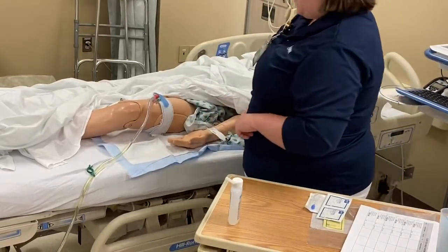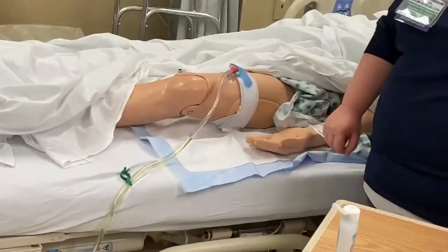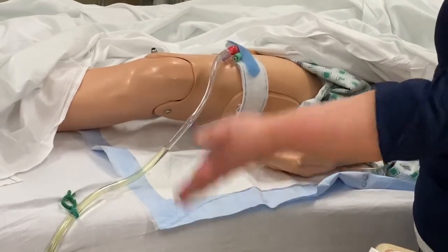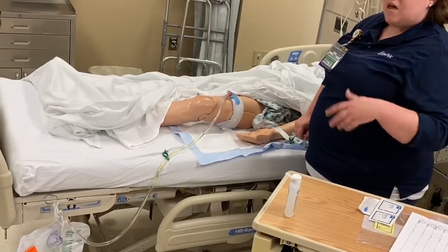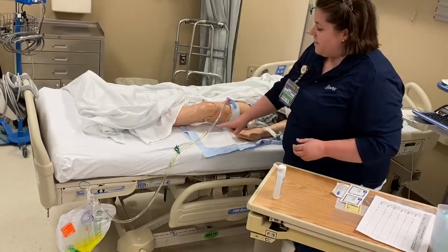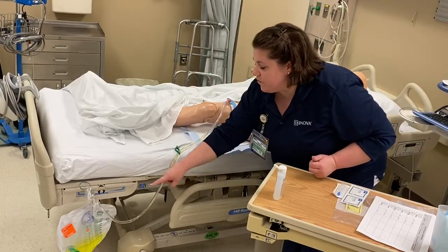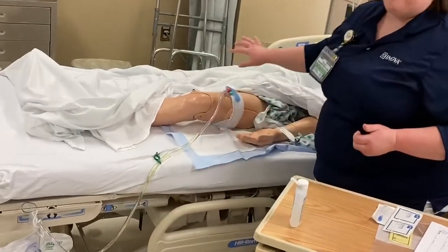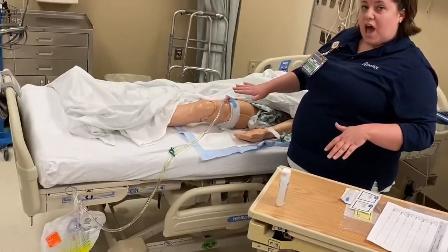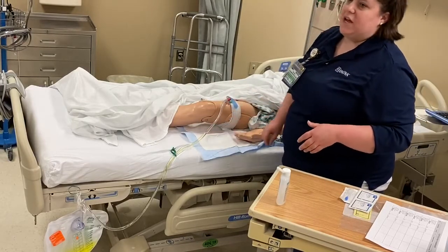The first thing that I wanna do is empty the Foley catheter of any urine, and I wanna draw your attention right here to some dependent loops that we have in the catheter. So if you remember from the video that you watched about the urinary system, when the catheter has a dependent loop, it actually keeps the urine from entering into the bag, and it can back up in the bladder and put pressure on the bladder. So when I finish, I'm gonna make sure there aren't any dependent loops because I don't wanna cause the patient any harm.